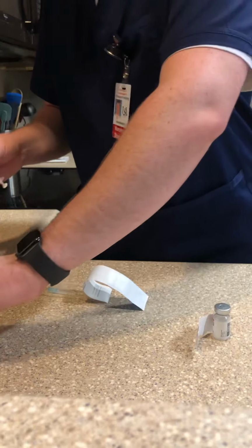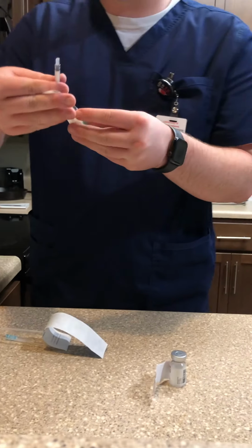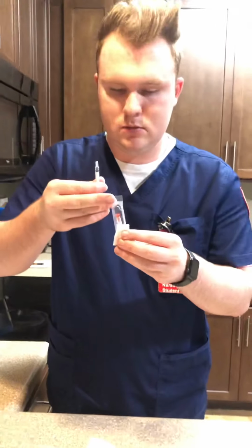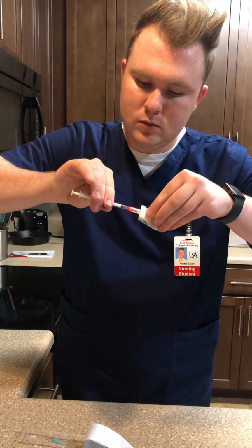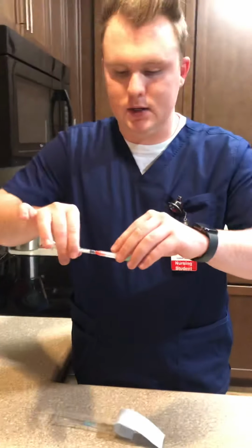Now I'm going to get my blunt tip cannula. I'm going to open it and connect the two. Okay, I can set this down. I'm going to take this off.